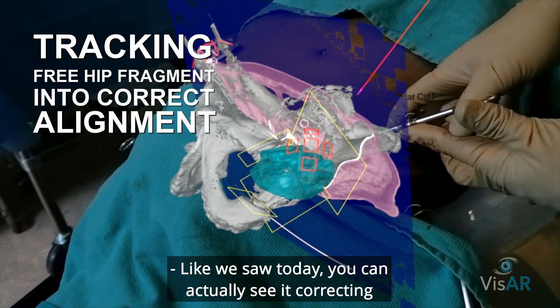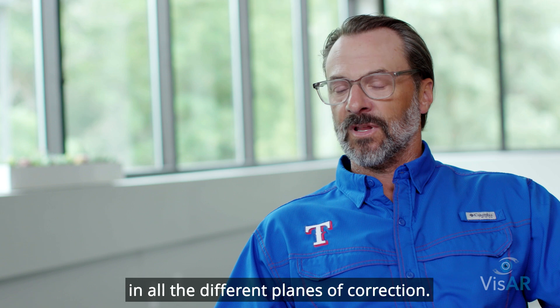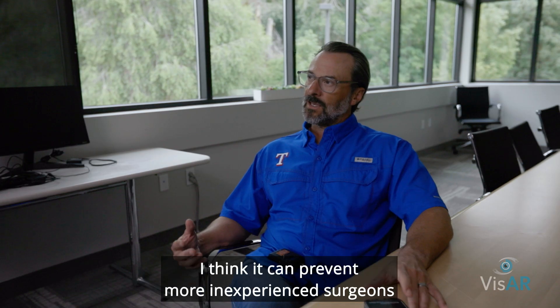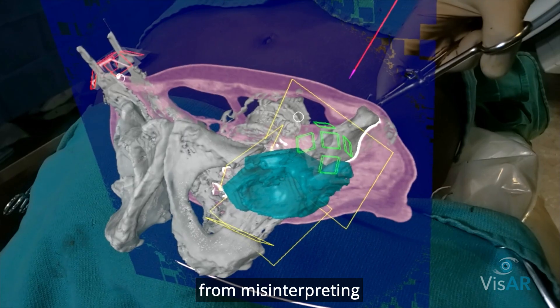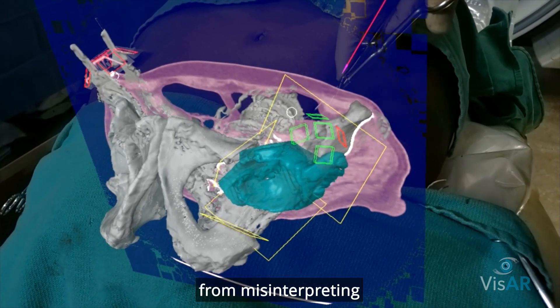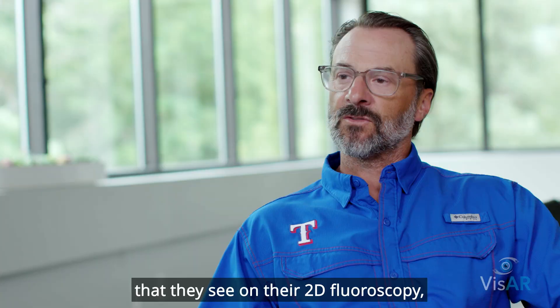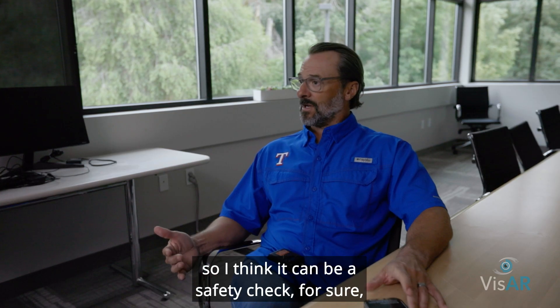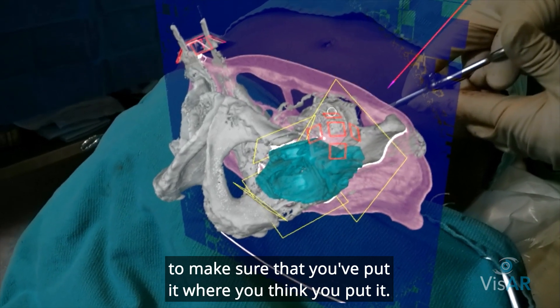Like we saw today, you can actually see it correcting in all the different planes of correction. I think it can prevent more inexperienced surgeons from misinterpreting the amount of correction they see on their 2D fluoroscopy. So I think it can be a safety check, for sure, to make sure that you've put it where you think you put it.